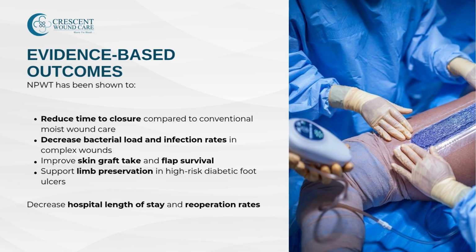Now, let's look at what research tells us about NPWT. Numerous clinical studies and meta-analyses support its effectiveness. Key outcomes include accelerated wound closure compared to traditional dressings. This means shorter healing time and reduced morbidity. Lower infection rates, especially in surgical or traumatic wounds, due to the controlled environment and removal of exudate.